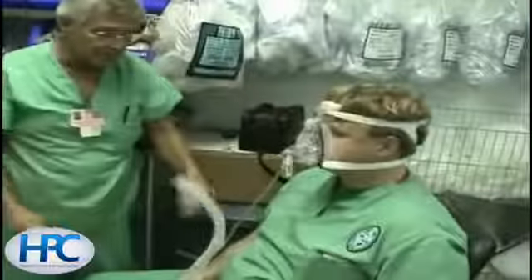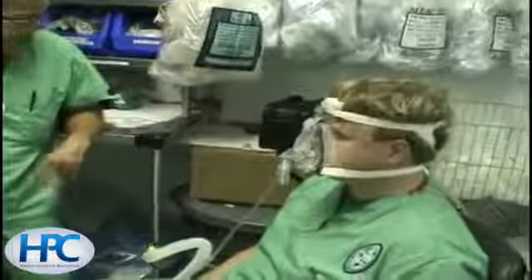Alarms are set on the machine with a low pressure alarm if the tubing becomes disconnected.